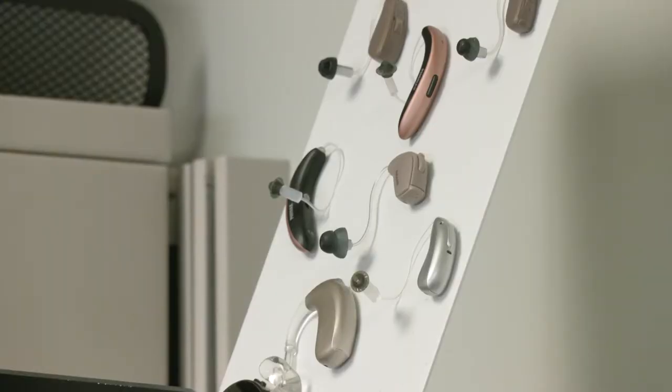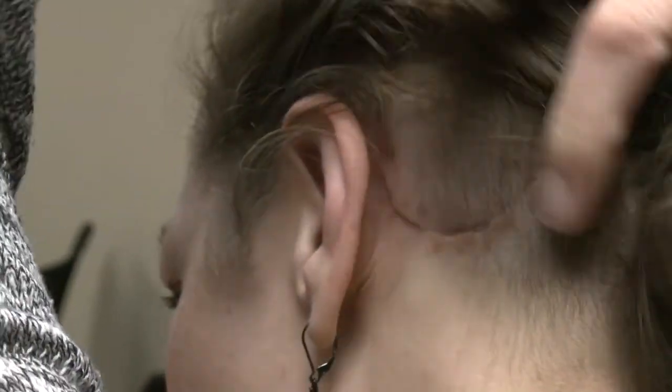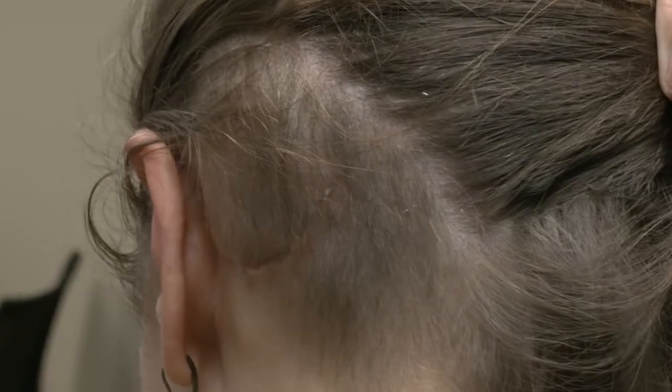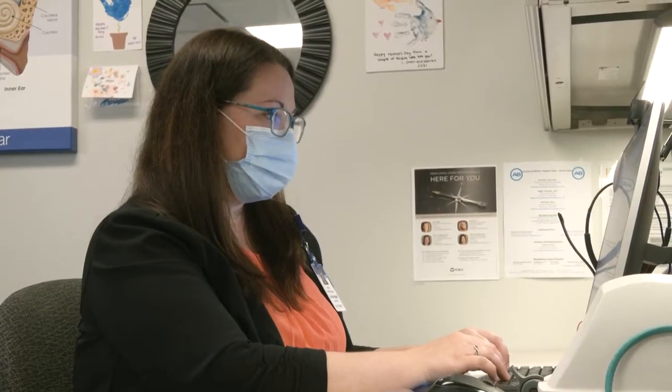That's what happened with Duke. Her ear infections went away, but when hearing aids didn't work for her, Dr. Shinners provided one more option: a bone conduction implant. She has relatively decent hearing for her inner ear, and that's why we're still able to use it via bone conduction. At the Sanford Detroit Lakes audiology offices, Duke tested her device alongside Doctor of Audiology Mary Richter.